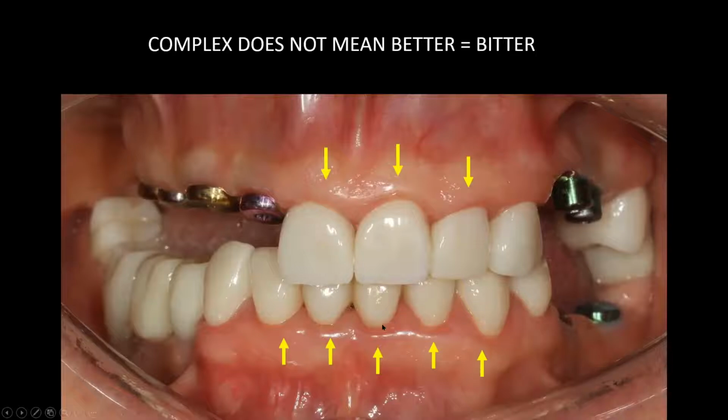Can you see that? Do you have any radiographs of this particular patient? I didn't want to show the radiographs because you wouldn't like what you see. We've got to see it. I agree. I've got a CT scan, but I didn't want to show it. There's bone loss here, Stan. And I'm just looking at the occlusion here. I don't know, there's a dip here.